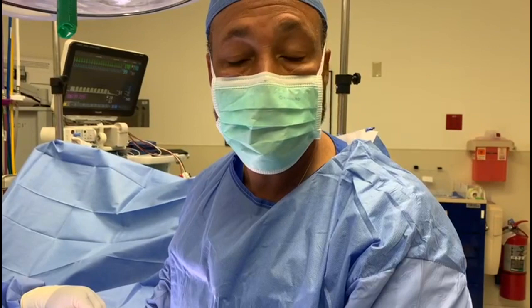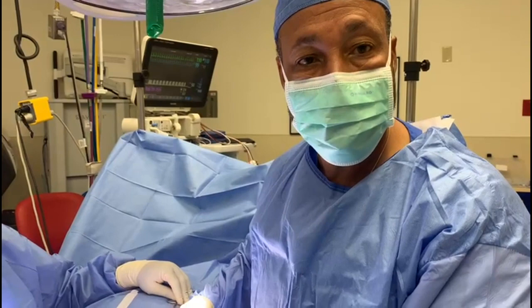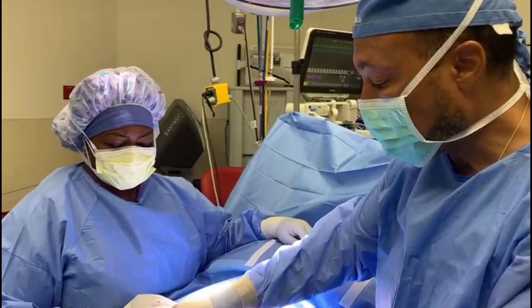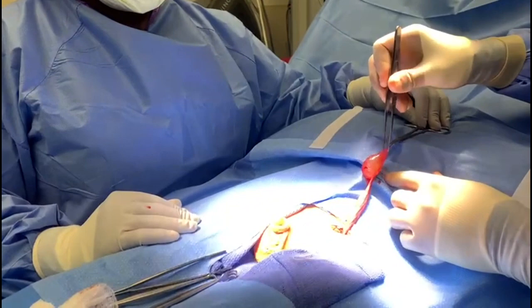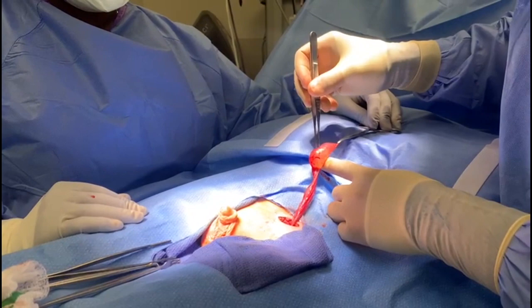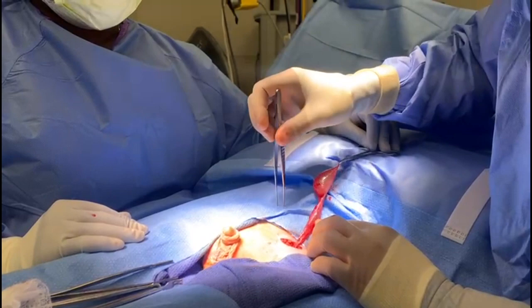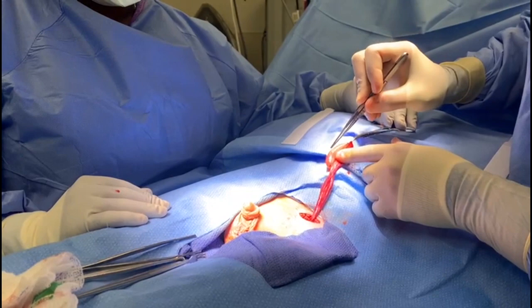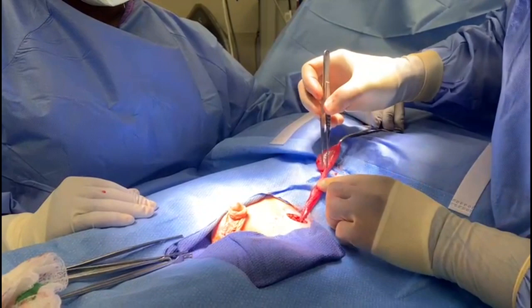Typically when we enter the inguinal space, we bring the testicle up — we've delivered it now. You're going to see the hernia is usually posterior; however, this one is anterior and also loculated. So it's a little unusual in that he's got a distal component. Once we remove the gubernaculum, we have the testicle inside the hernia here. This is lying on the anterior and it's a loculated one. We have the hernia that comes to the cord and then a very small ostium that connects between the distal hydrocele hernia and the proximal one.